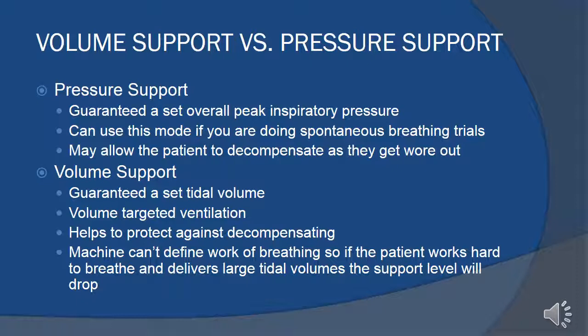And as the tidal volumes decrease, inevitably what may happen if someone doesn't notice this in time is they may decompensate or de-recruit, as we talked about before. And then what happens is they start to show clinical manifestations such as desaturating, increased heart rate, increased respiratory rate, increased work of breathing. And that's when we notice there's a problem and we switch them back to the mode they were previously in. Usually by the time we do this, it's too late. They've already decompensated a bit, which is not a good thing.